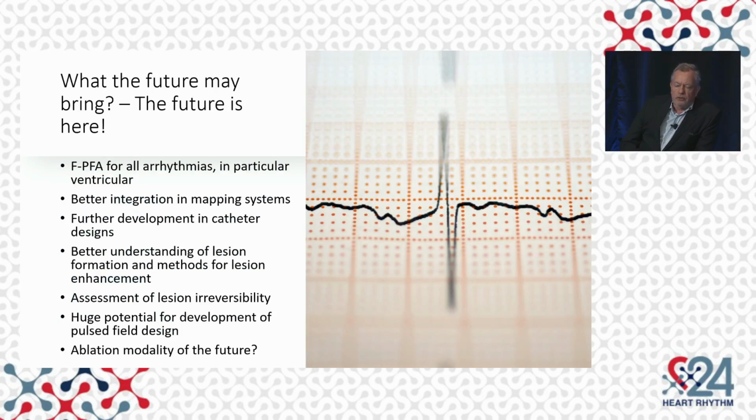It's difficult to make predictions, especially about the future, but it helps that it's almost here. I think focal PFA is an attractive tool, in particular for ventricular arrhythmias. I hope we'll see better integration into mapping systems.